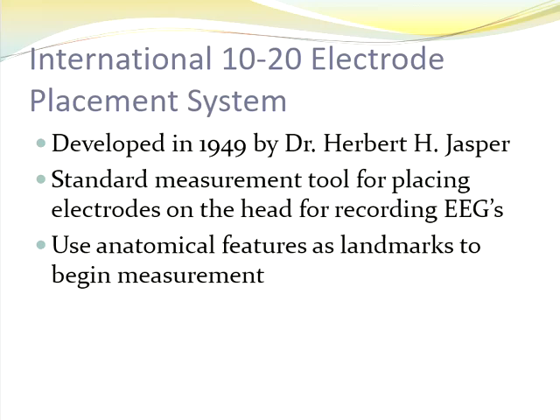We utilize the International 10-20 electrode system. It was developed in 1949 by Dr. Jasper, and it's essentially a standard measurement for how we apply the electrodes on the head for recording the EEGs. In the name, it's international, meaning that you could have a sleep study or an EEG done in New York, California, Canada, Italy, wherever. Your head is going to be measured exactly the same way to apply those electrodes to the scalp. That's for reproducibility of a study.